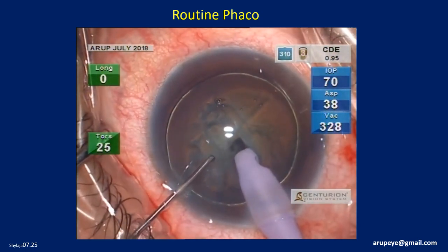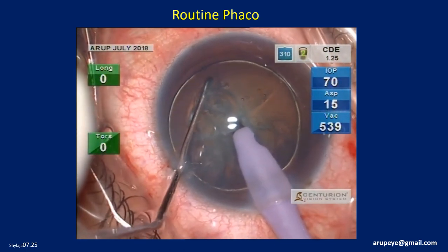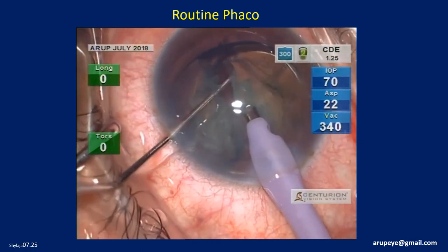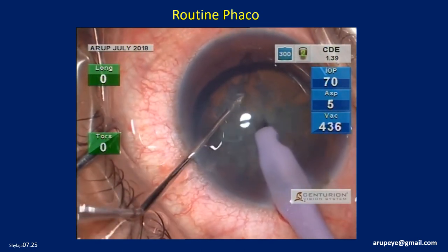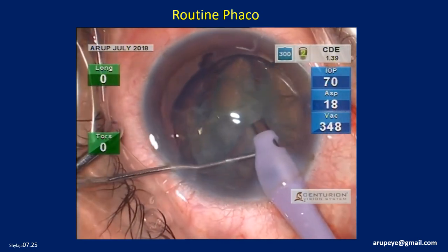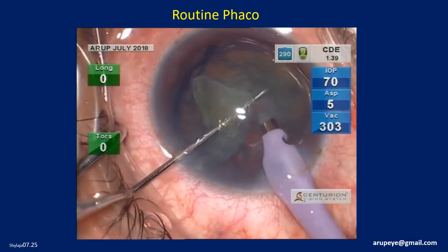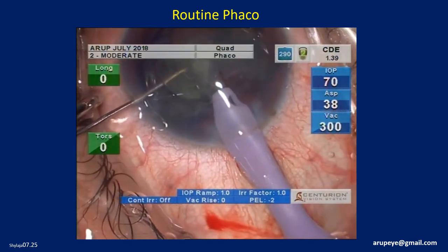In this case, chopping is carried out using the Sinski hook itself. The nucleus is chopped into multiple small pieces. The nucleus appears quite brittle. Quadrant removal parameter settings are activated to remove the first loose nucleus piece, and the rest of the nuclear disassembly is continued using the same settings.